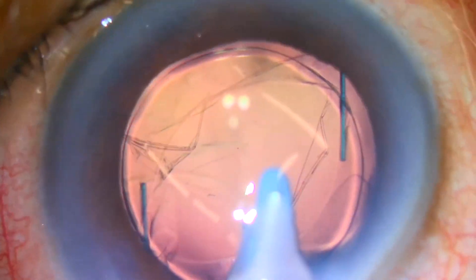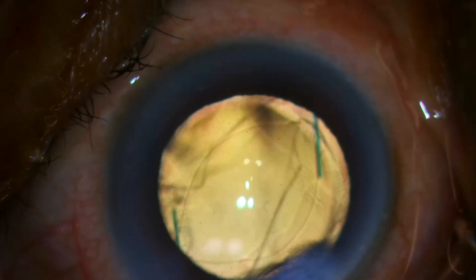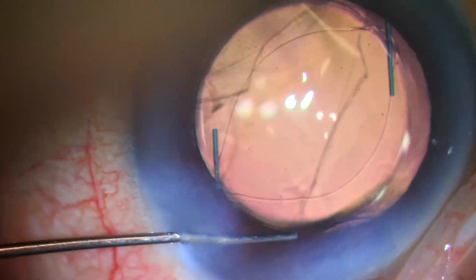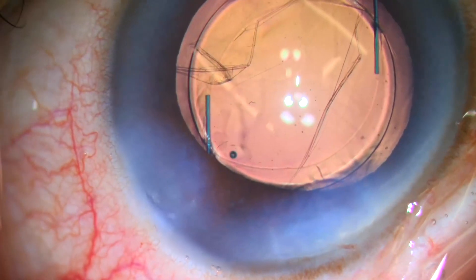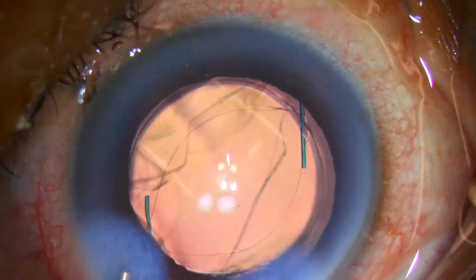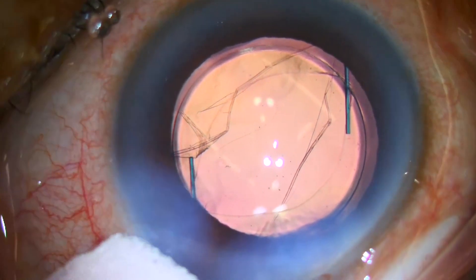We can then safely remove the viscoelastic from the anterior chamber. We then hydrate our corneal incisions, then use a cyclodialysis spatula to sweep the iris and the area below our incisions to see if there's vitreous prolapse or incarceration to our corneal incisions. In this case, there's no vitreous prolapse despite the PC break. The IOL is in the capsular bag, and the patient had a beautiful, normal visual result. This is a good example of how I manage the PC break if the posterior capsule tears during irrigation and aspiration.